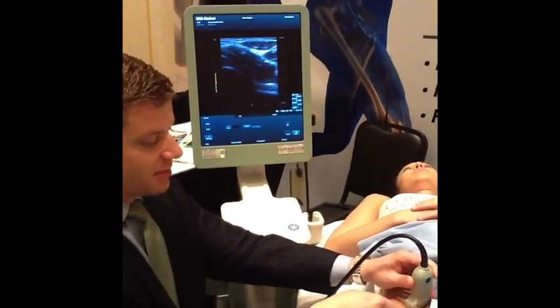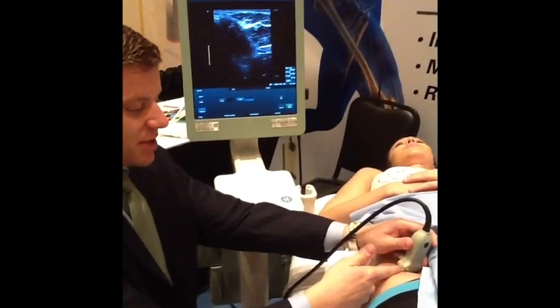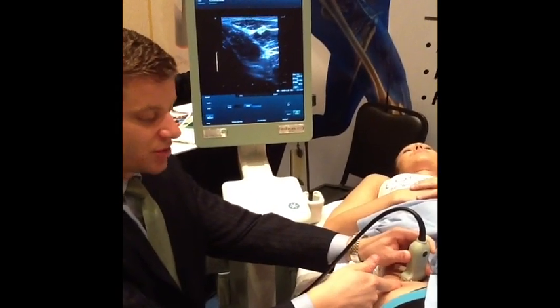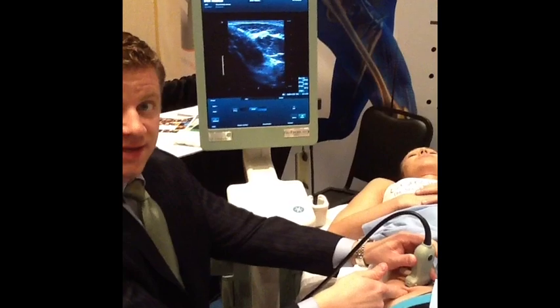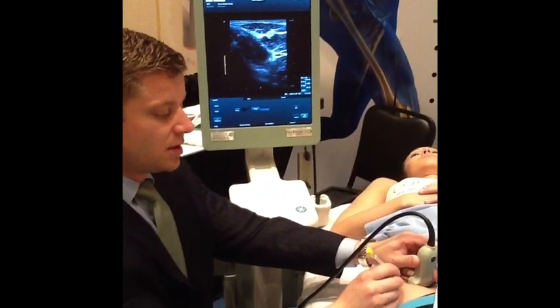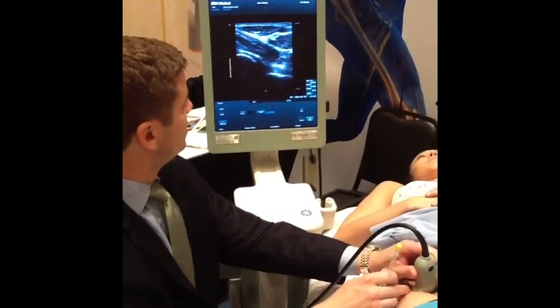Your needle would go in line with the probe here and you would come straight in like this. So your needle would come in just like this.